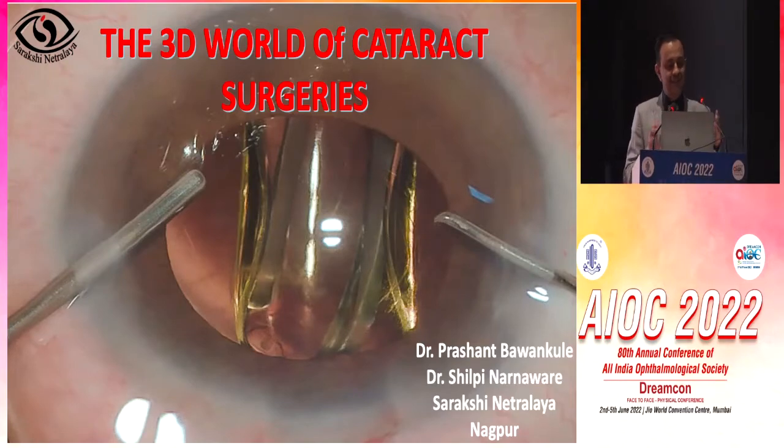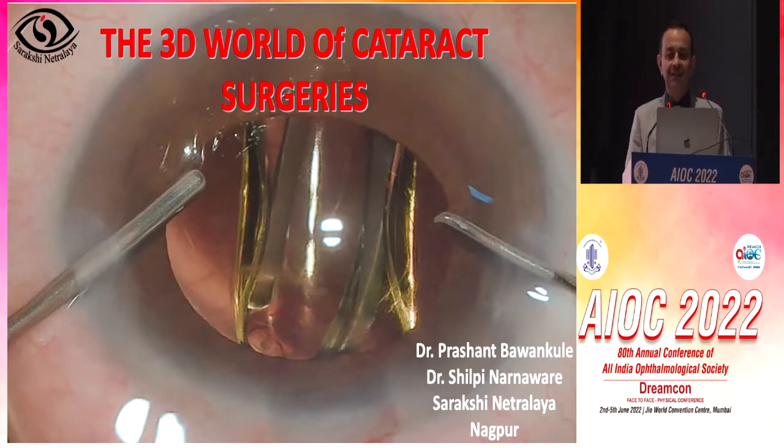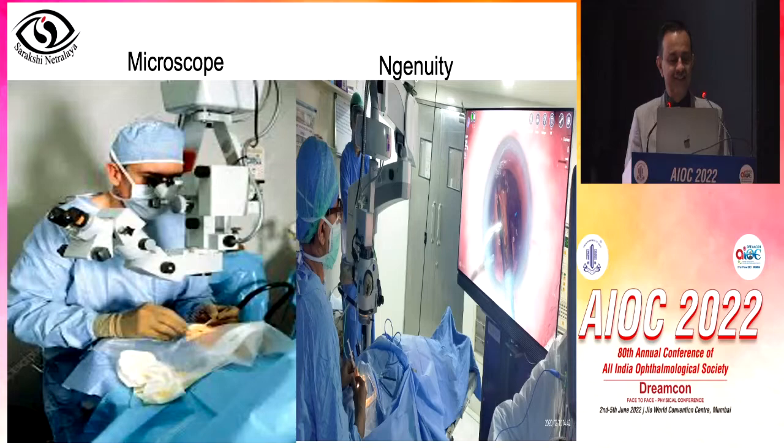Thank you, Naresh, for getting me into this particular IC. Yes, the 3D digital assisted surgery for us is day in, day out. It's more than 4 years, with more than 20,000 plus cases done already on this system, which has established its role, at least in our ORs, as an integral part. It's by choice. If I have 2 theaters, most of the complicated cases happen in a 3D digitally assisted case.